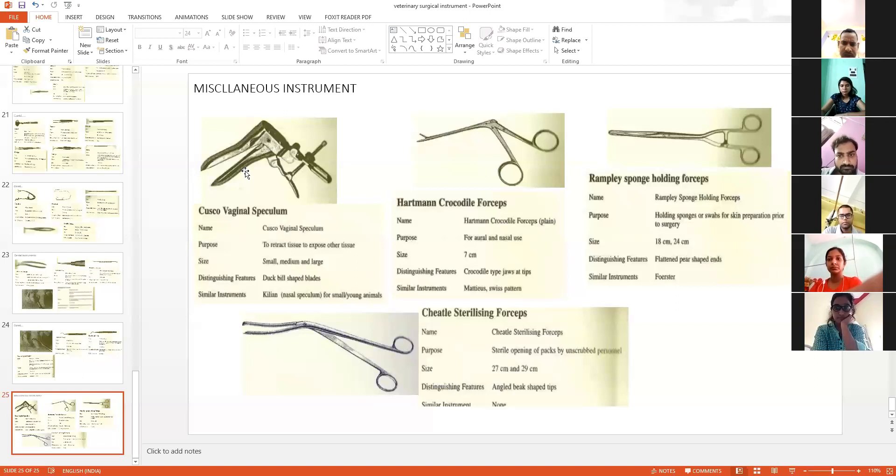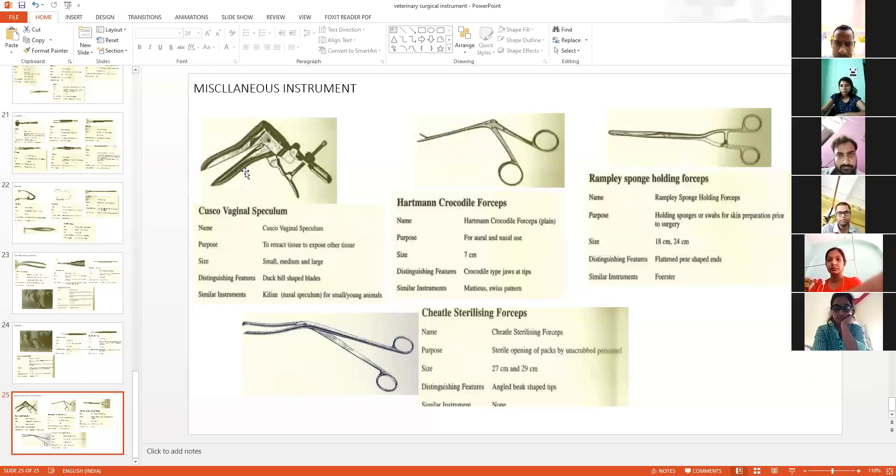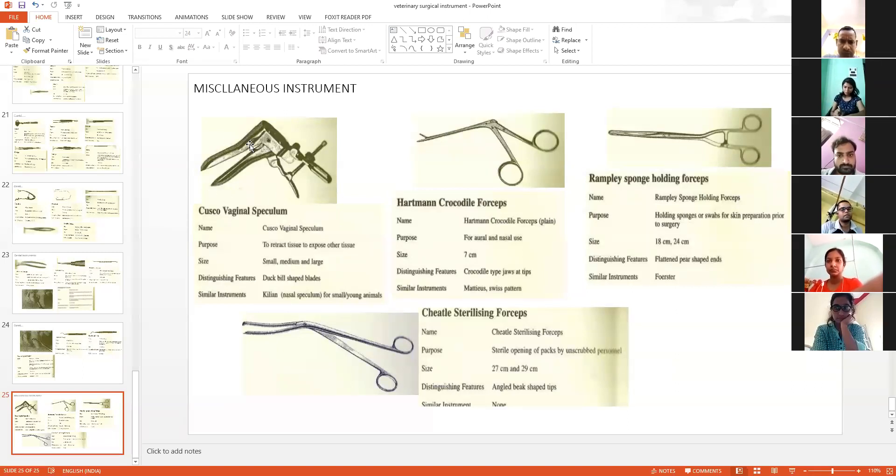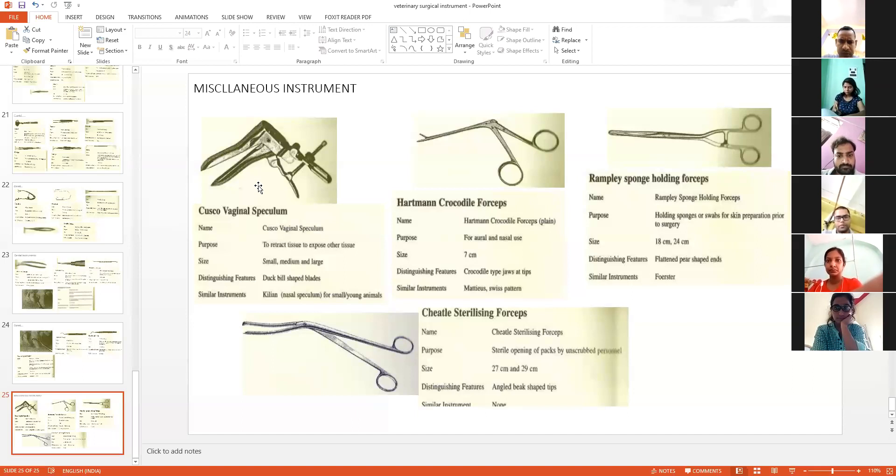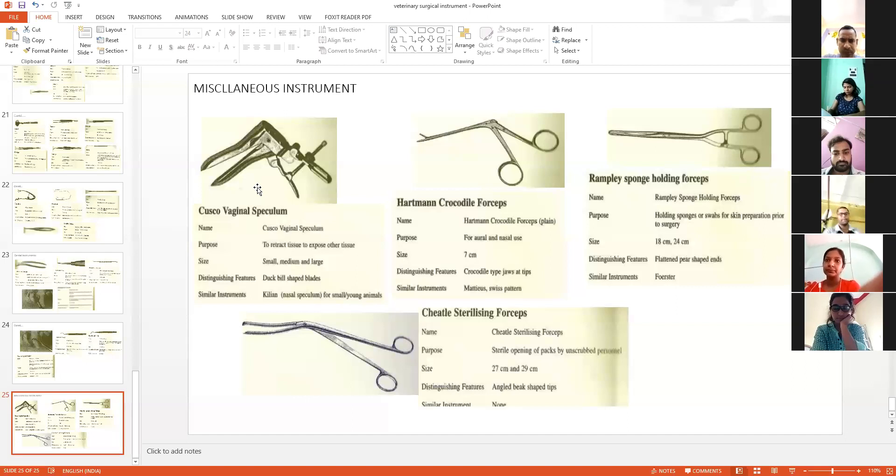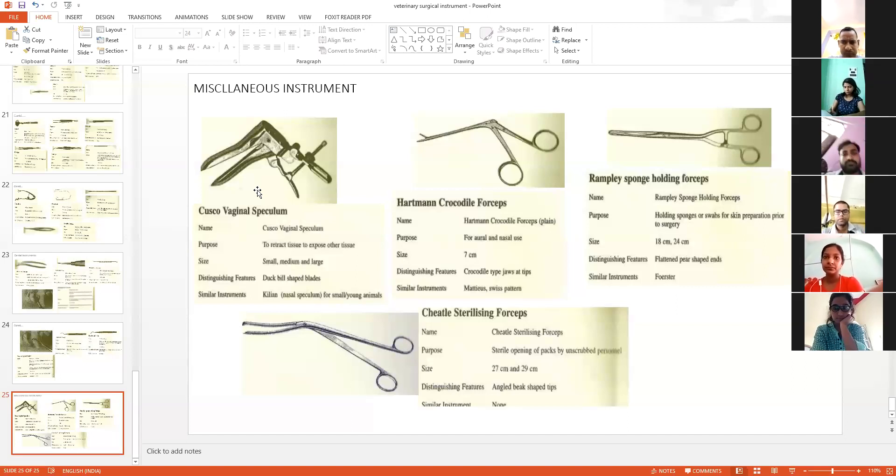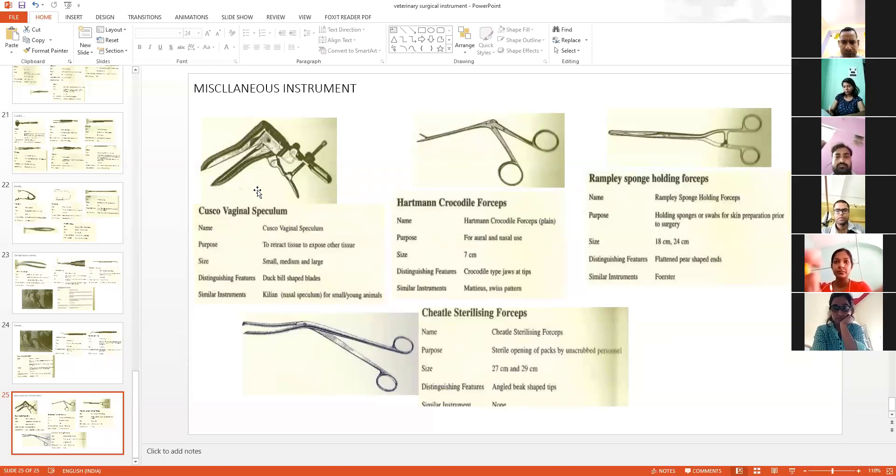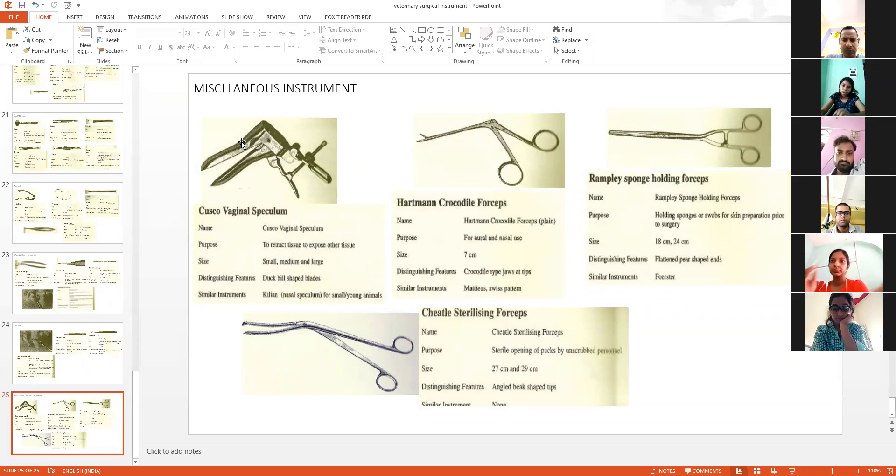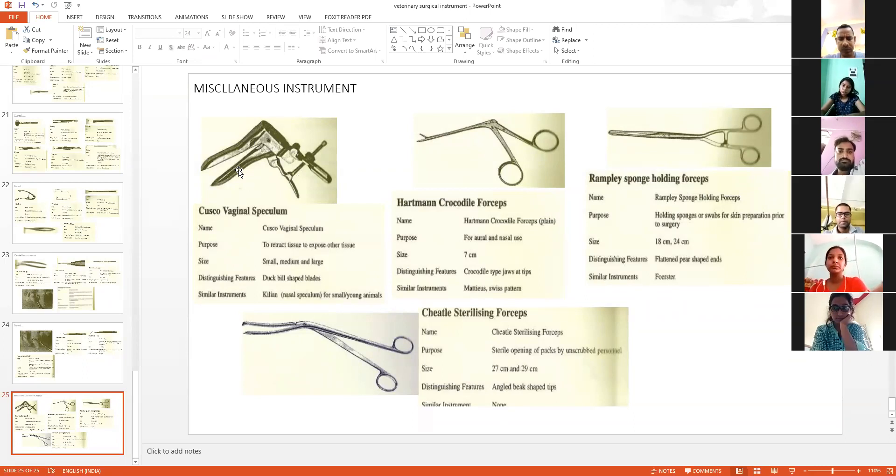The urethral opening is a little bit inside the vaginal folds. By using this vaginal speculum, you are able to see the vagina and the urethral area, and you can easily insert any type of catheter, like an indwelling catheter. By using this vaginal speculum, you can do your job efficiently.